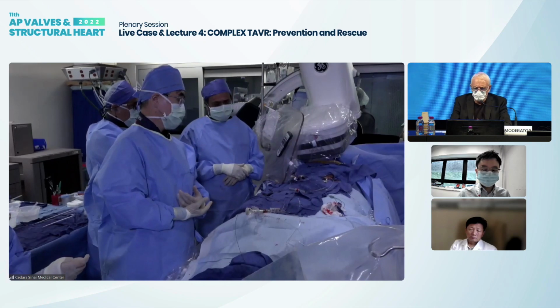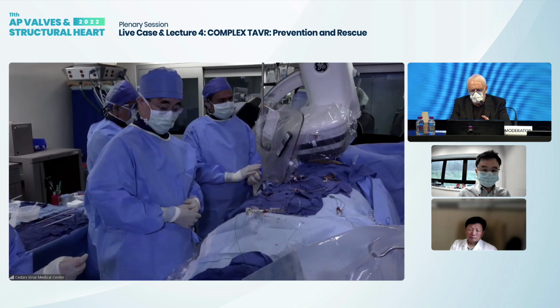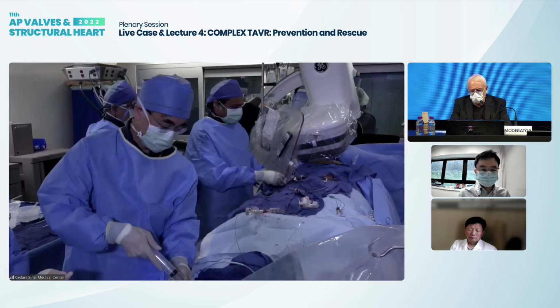Yeah. Raj, just one question. When you do pre-dilatation, the main reason, obviously, like what you said, is to ease the entry and the passage of the catheter.